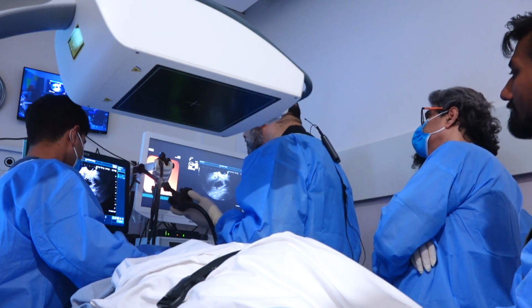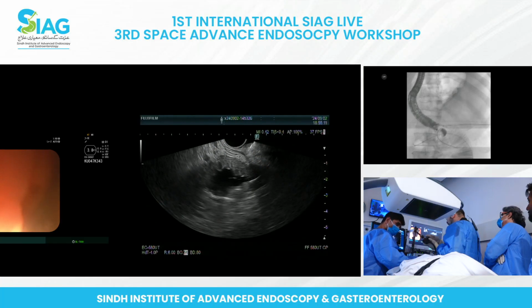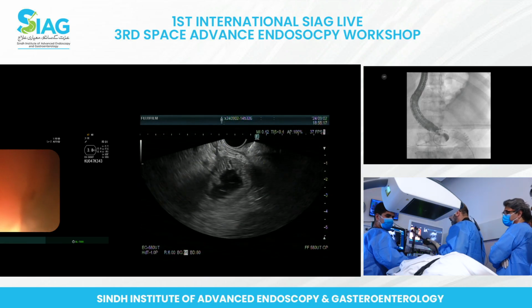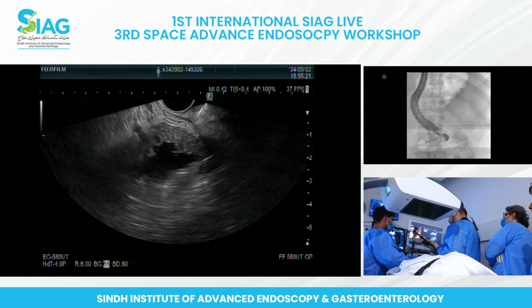So we're having continuous cautery going. I think I feel comfortable with this because I have a decent landing area. And the fluoro also looks favorable. So cautery.